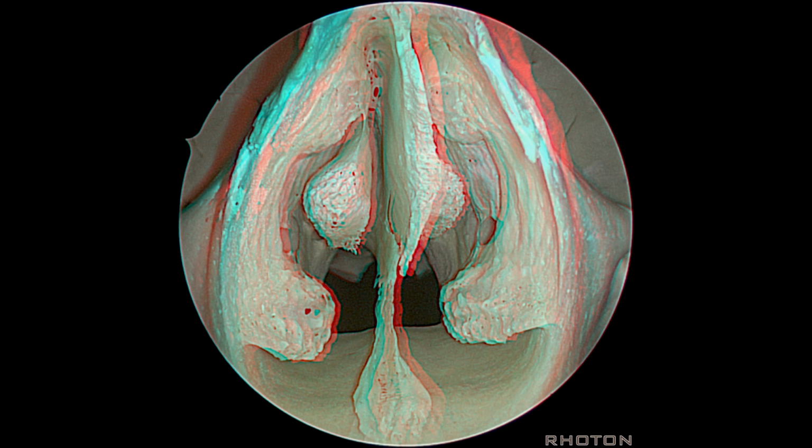Now we look into a nasal cavity. Here below we see inferior turbinate, middle turbinate, perpendicular plate, vomer, cribriform plate. It really is a very narrow route up to the cribriform plate. And we see in the back here a superior and a supreme turbinate.